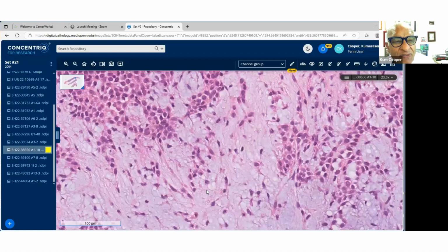As you know, they carry a specific translocation involving NR4A3, I beg your pardon, and EWSR1 or TAF15. We typically have a FISH probe for NR4A3, and that was negative in this case. But that would be an important differential diagnosis. They tend to occur in the extremities. So this is in the buttocks, so maybe proximal extremity. So that's a good thought, a good start for that as well.